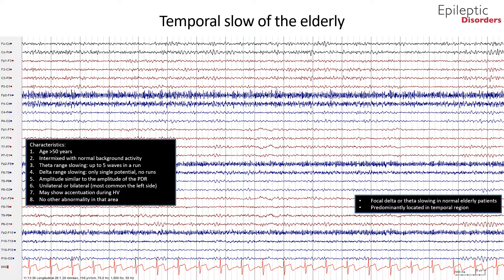Characteristics of temporal slow waves of the elderly include age greater than 50 years, intermixed with normal background activity. If in the theta range frequency, you could see up to five waves in a run; if in the delta range frequency, you could see only a single potential — no runs. The amplitude of temporal slow waves of the elderly is similar to the amplitude of the PDR, and they are unilateral or bilateral but most commonly on the left side. They may show accentuation during hyperventilation with no other abnormality in that area.